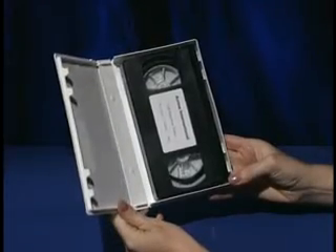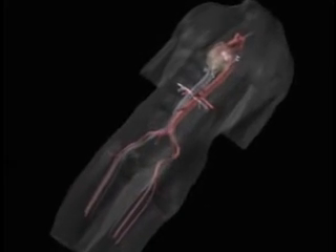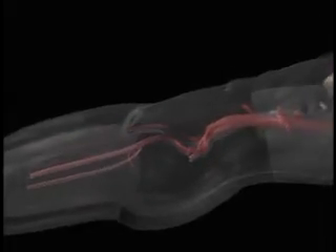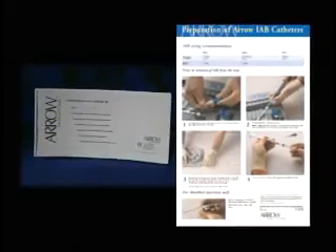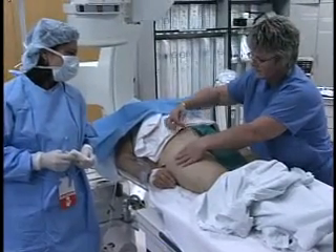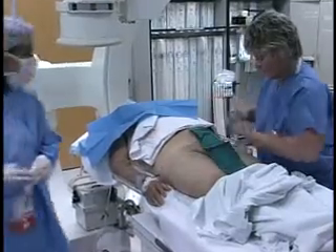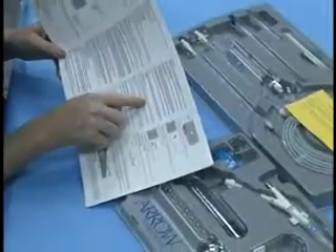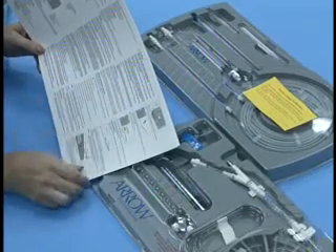The insertion instructions described in this video presentation are exclusive to the Arrow Percutaneous Universal Intra-Aortic Balloons and are intended as an educational tool. Complete insertion instructions are included with every catheter. Insertion of this device is recommended by trained personnel only. In addition to the physician, the availability of a second scrubbed clinician may be beneficial to facilitate the insertion procedure. It is recommended that the insertion instructions included in the packaging should be read in their entirety before attempting the procedure.